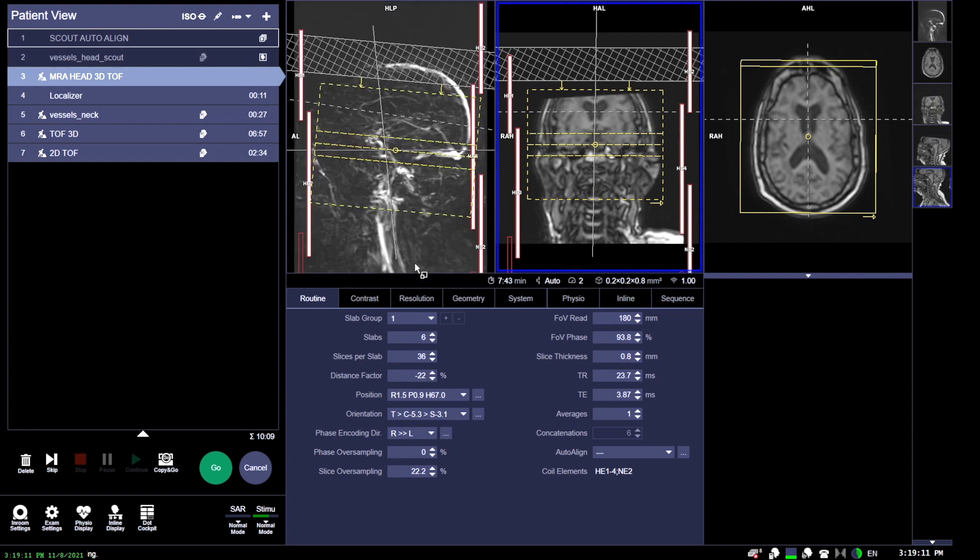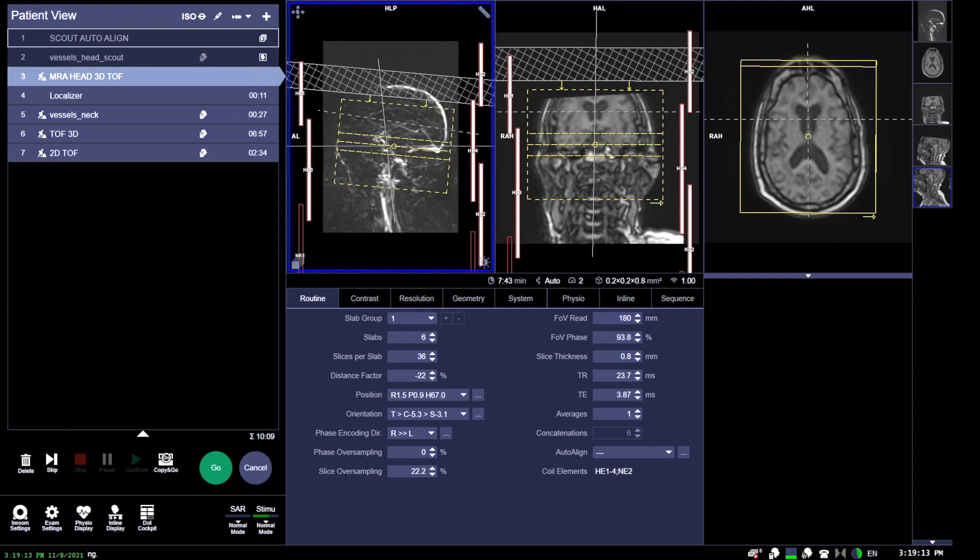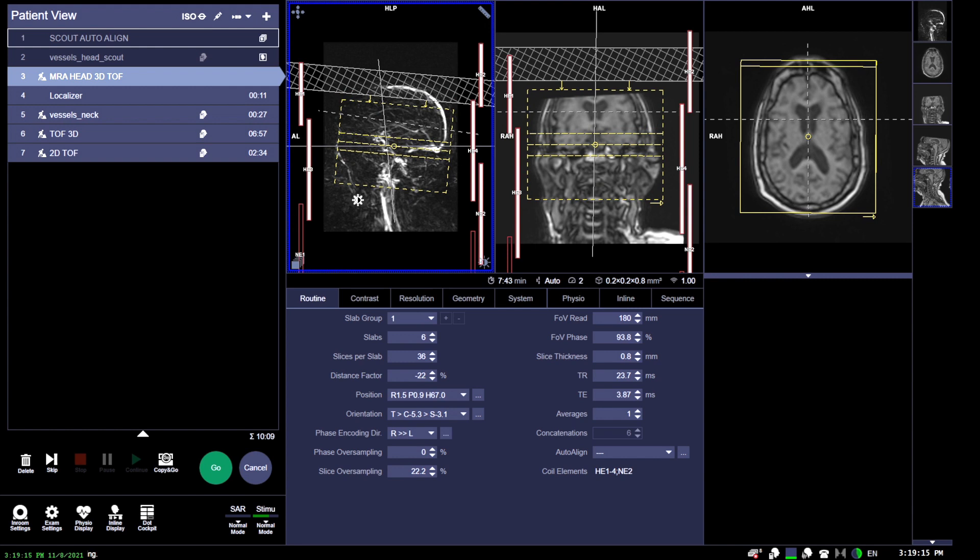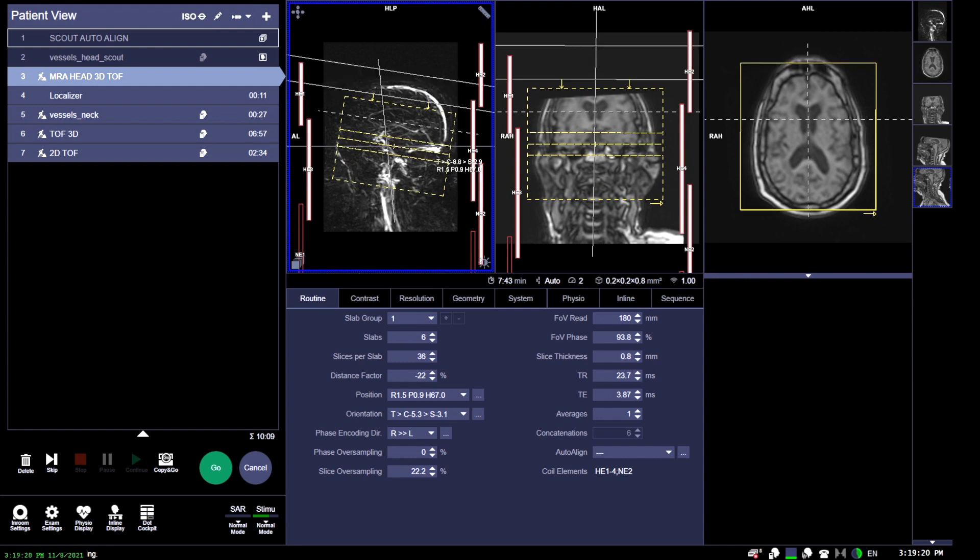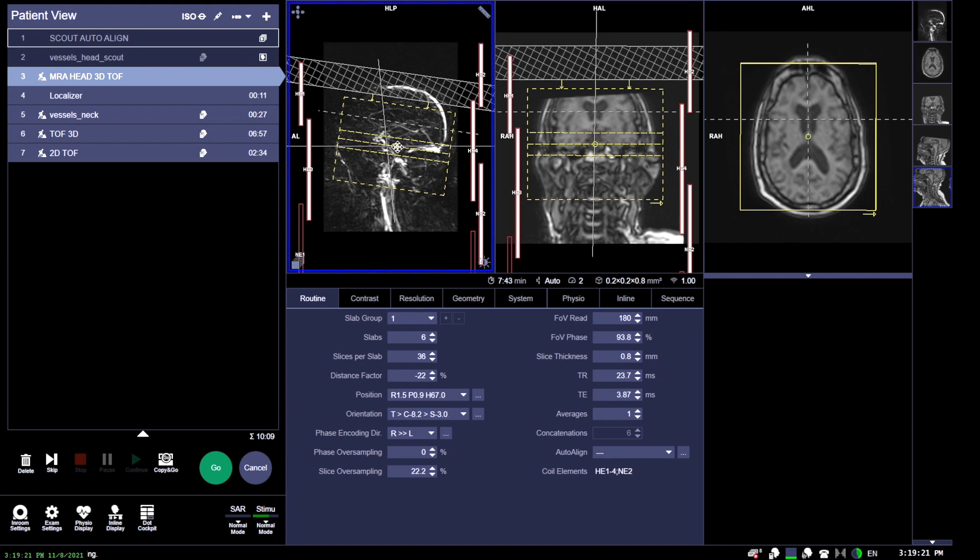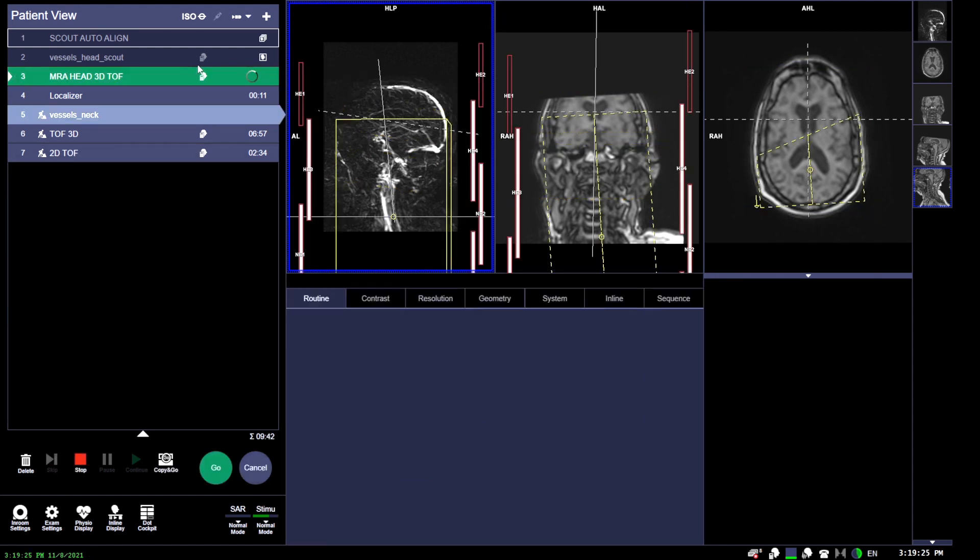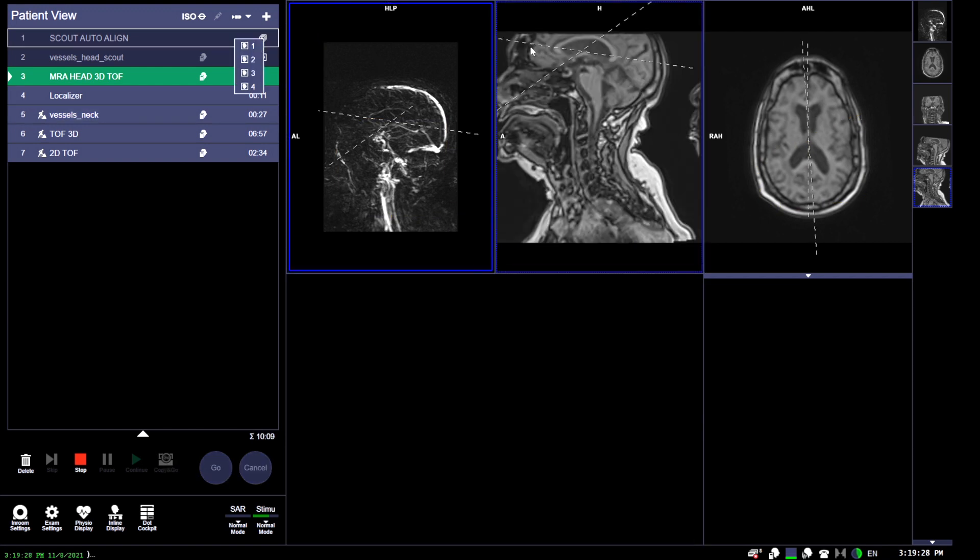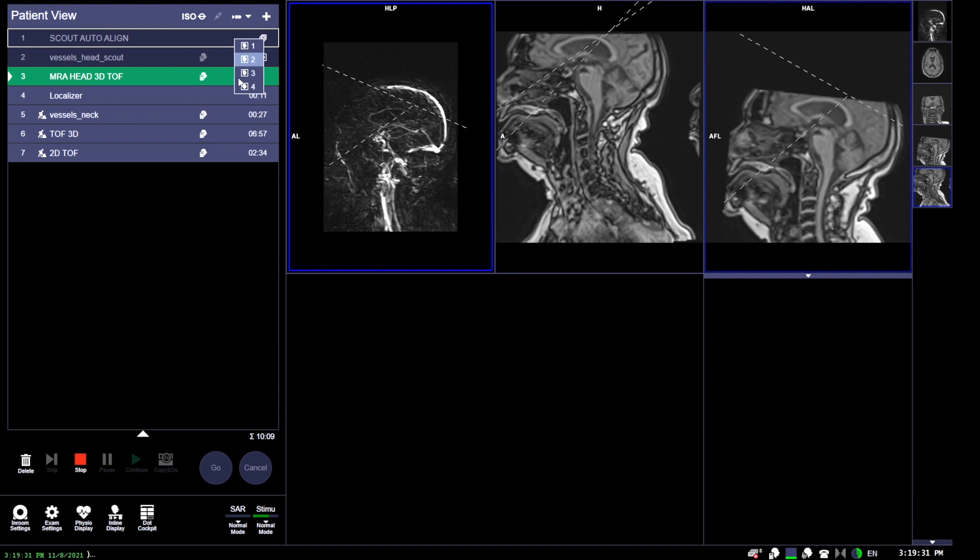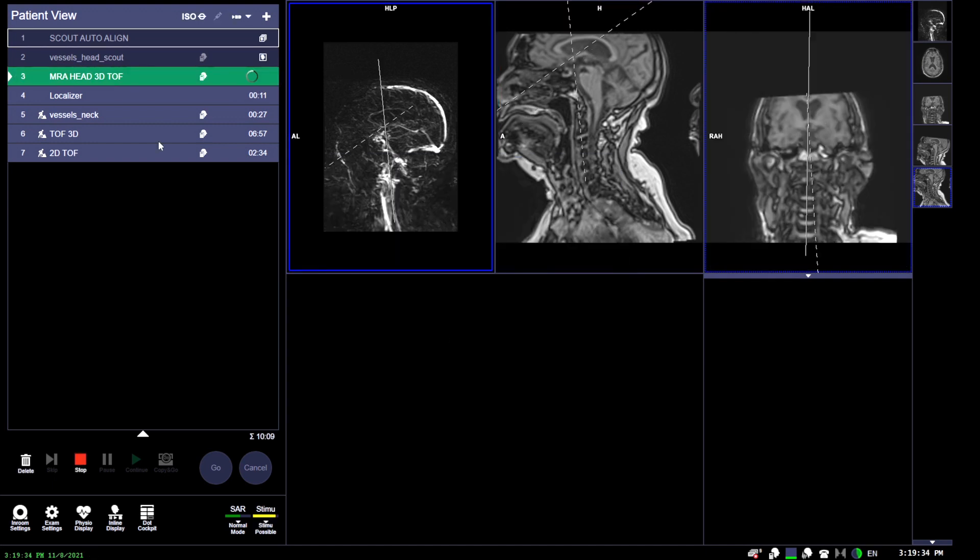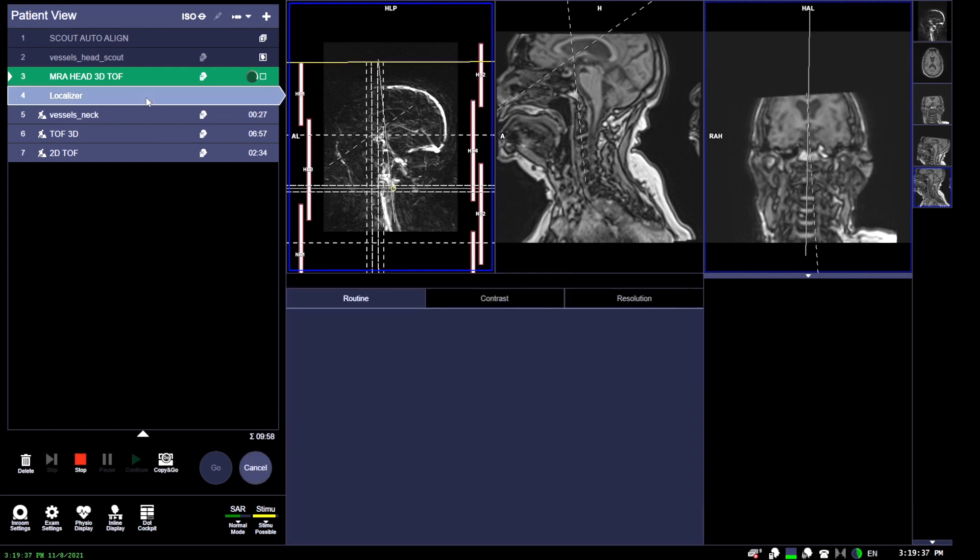In the meantime, we're going to go over some typical MRA head protocols. Usually, depending on every site—like we always say, no site is created equally—a good way to start is a nice sagittal T1 brain. This is going to outline any midline structures so we know exactly where in the brain we're looking at and allows us to cover exactly where we want to cover from that sagittal standpoint when we're putting out those axial slices.